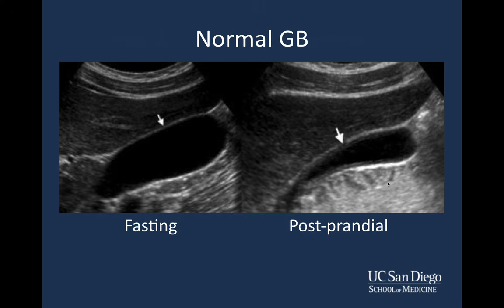This is a postprandial gallbladder, so it's also normal. However, it's important to note that if someone has recently eaten, the gallbladder will be contracted, and that will sometimes give the false appearance that the gallbladder wall is abnormally thickened. But if you don't have any pericholecystic fluid, you don't have any pain upon palpation of the gallbladder, and there's no obvious cholelithiasis, be wary that this could in fact just be a fake out of a postprandial gallbladder as opposed to an abnormally thick and inflamed gallbladder wall.